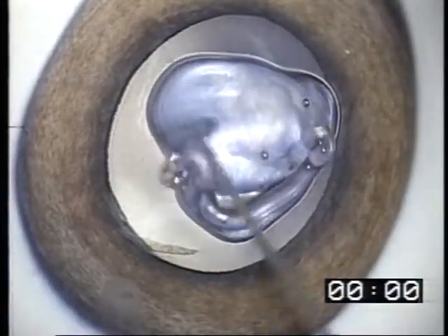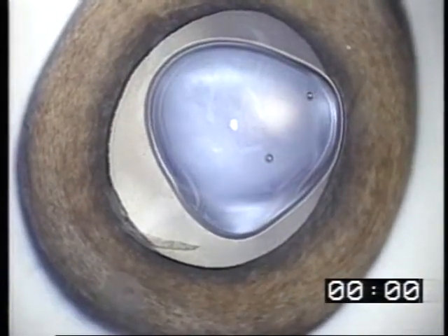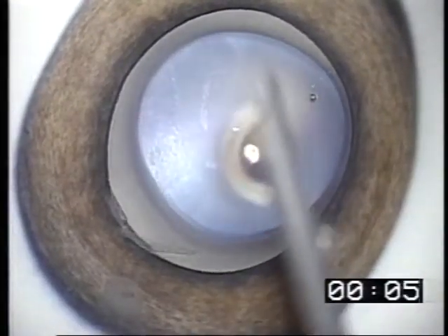When the eye of a pig was used, the visibility of lens was maintained without loss of moisture for about 30 minutes in this state. A time period of 30 minutes would permit completion of surgery on a patient with cataract without a complication.